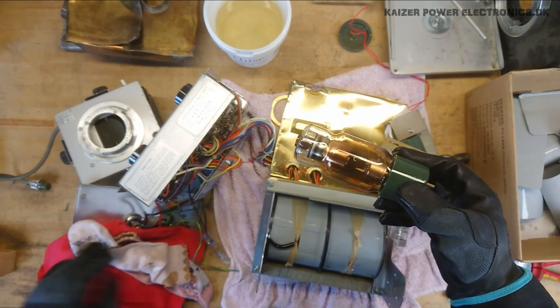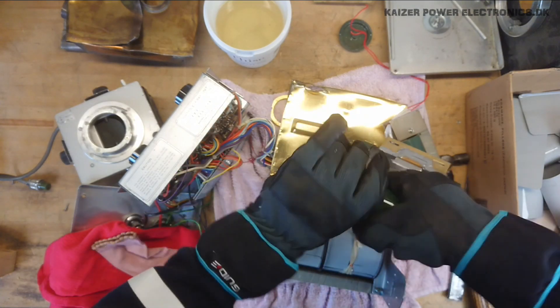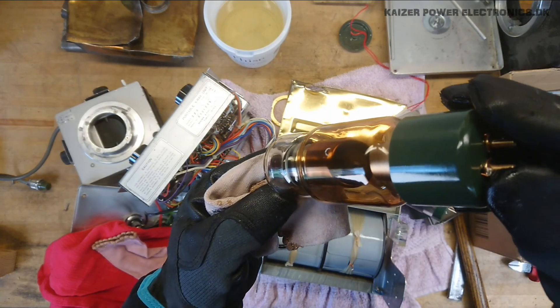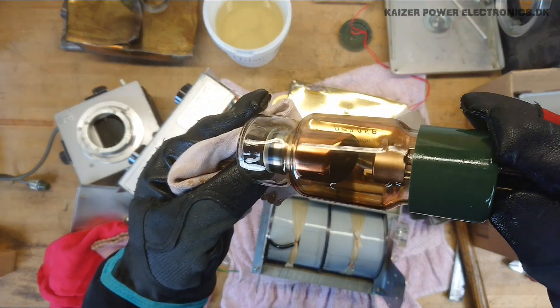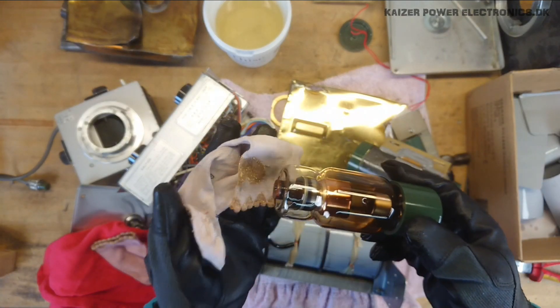And if we get a view of the anode here, it does have visible traces in the anode plate. So it has seen quite a lot of use.